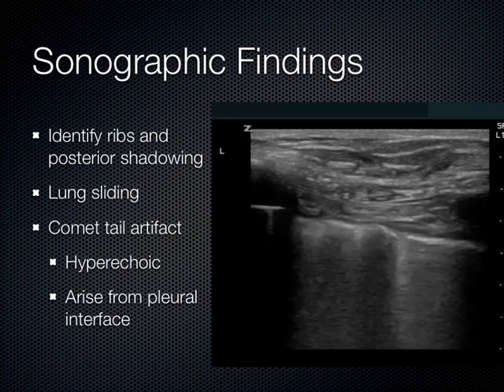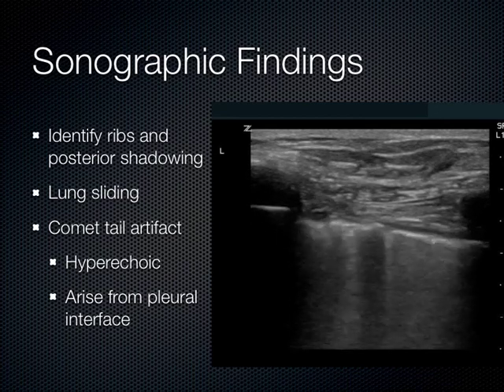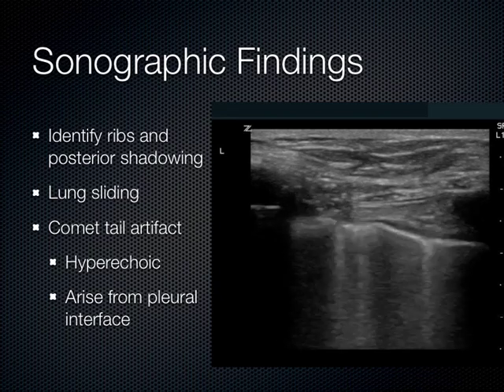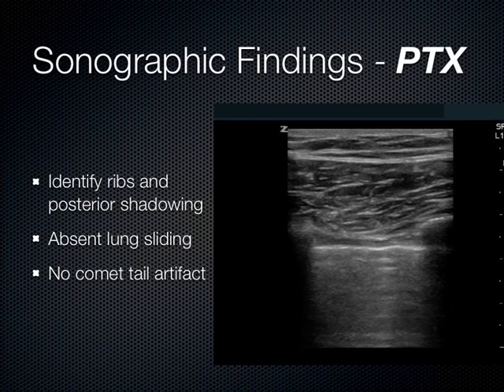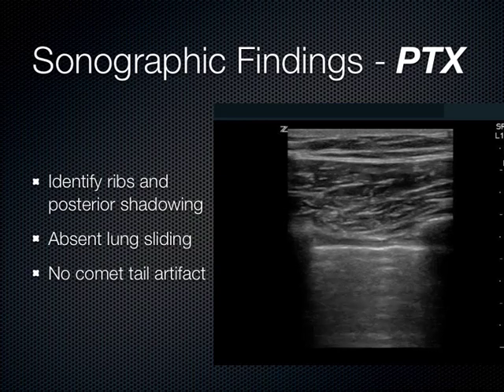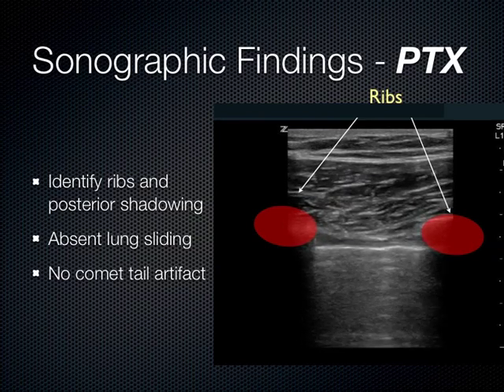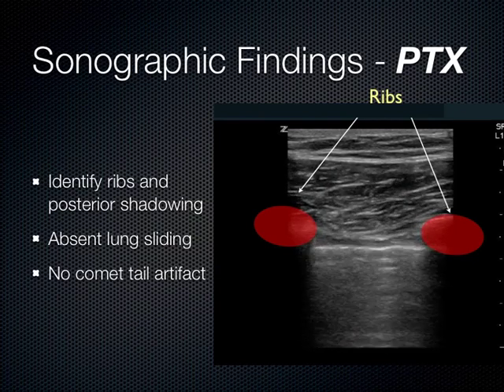Okay. Pneumothorax, however, this patient is breathing, not holding their breath. So you do see some movement of the chest wall because the patient's intercostal muscles are still contracting, but as far as the sliding, you don't see anything anymore. Sliding has been described by a lot of people as marching ants or shimmering. So what you're looking for is, it looks like little tiny ants are marching. If not, then you have to be concerned that the lung is not touching the chest wall. And there may even be the hint of an A line there at the bottom of the screen.